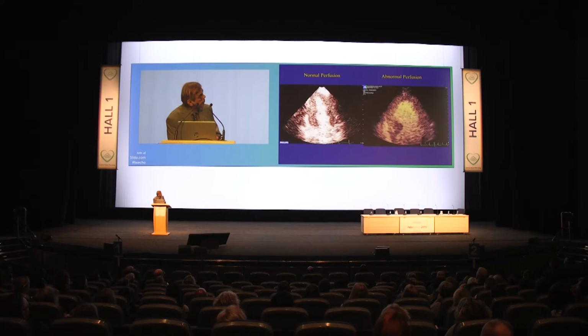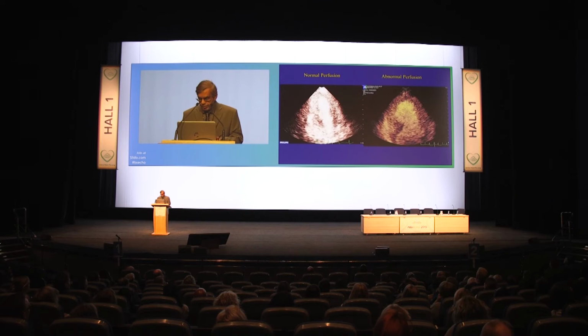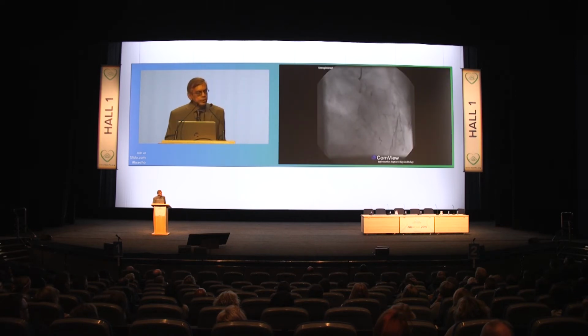And you can, just by this frame, say this patient has coronary disease, and this patient has multivessel coronary disease, and you can also predict that the LAD stenosis is less severe than the non-LAD stenosis, meaning the anterolateral is the circumflex region. So look at how it fills. It fills from epicardium to endocardium, right? And this is the angiography of the same patient.